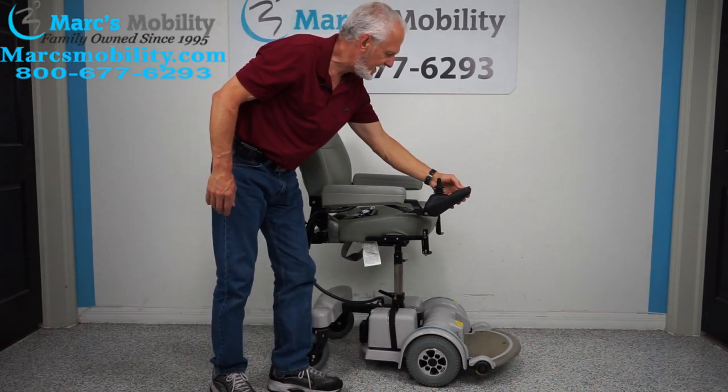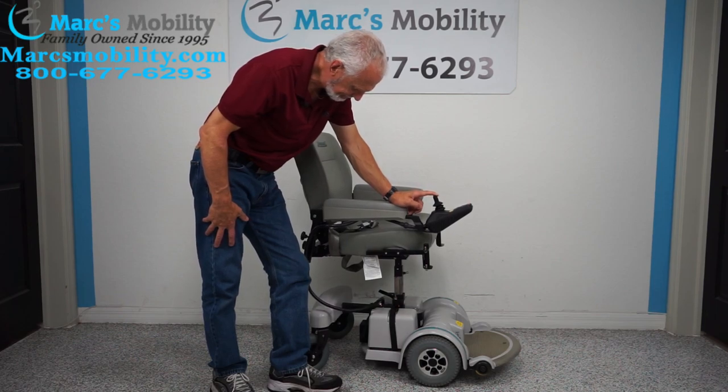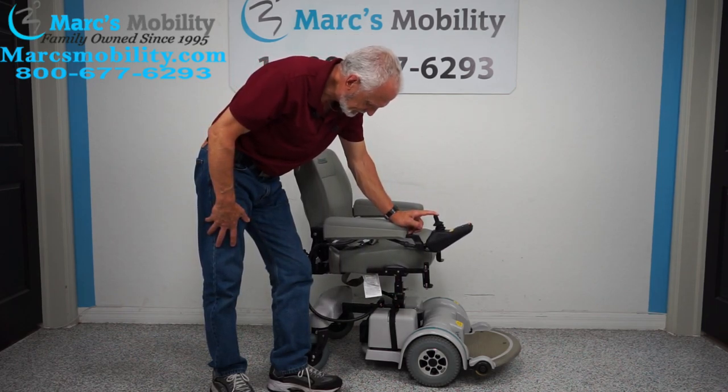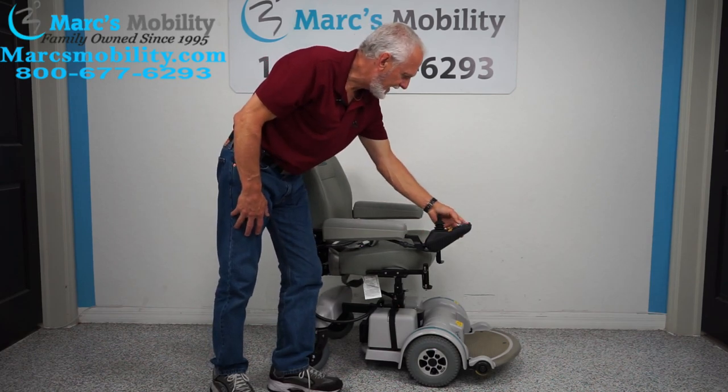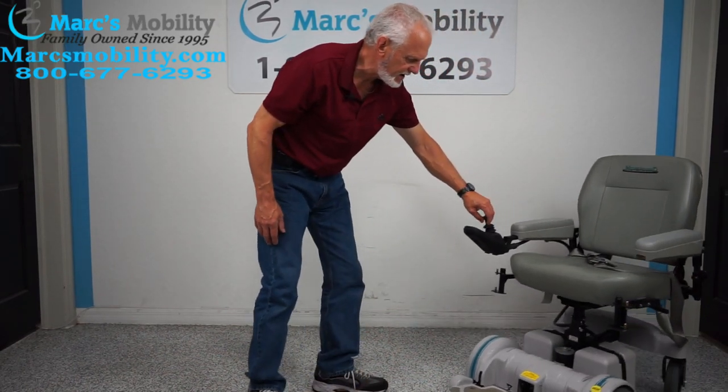Let me bring the seat back down. The seat's coming back down. We're going to put it back in drive, move the chair forward, and look at the front of the chair.